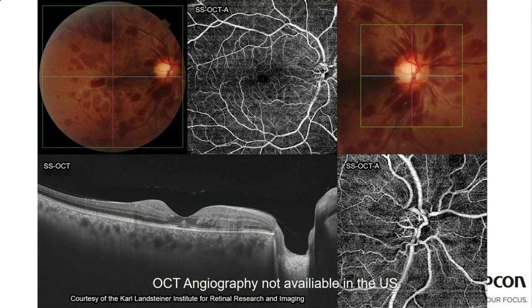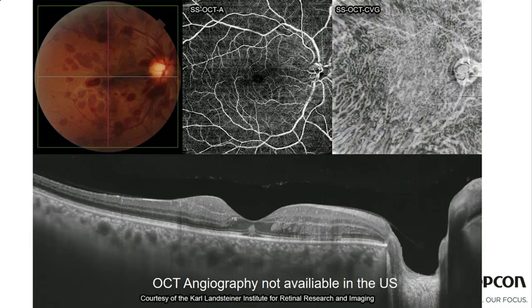So, as I'm always saying, what's important about OCTA interpretation is that you understand how it works, just like with ultrasound. And if you understand how it works, you can get it to work. So not only can we see that, we can also see through all of the hemorrhaging, you can see all of the choroidal vasculature. And that's, again, because of the penetration.